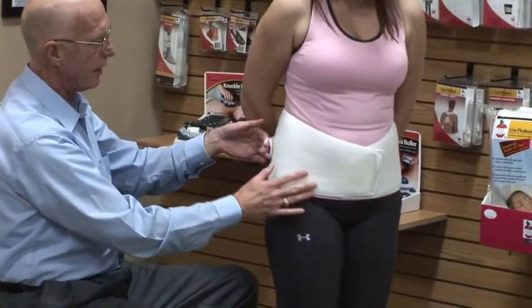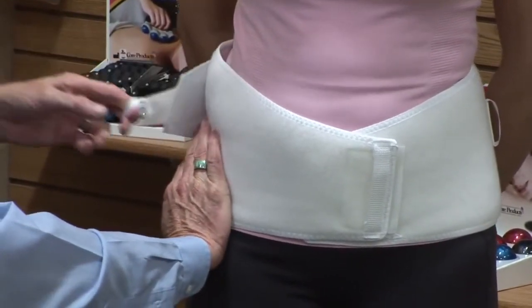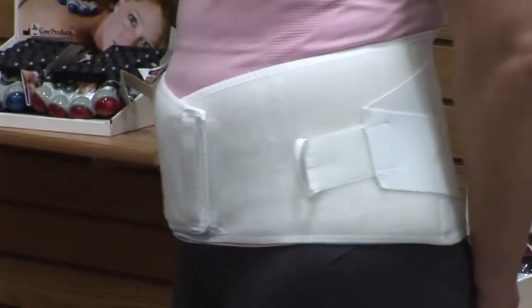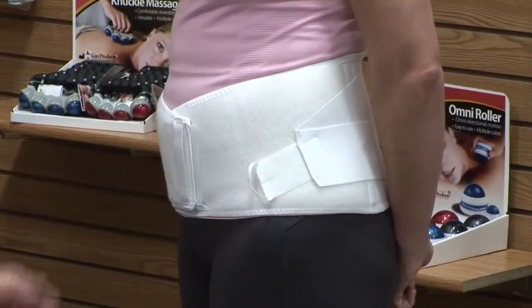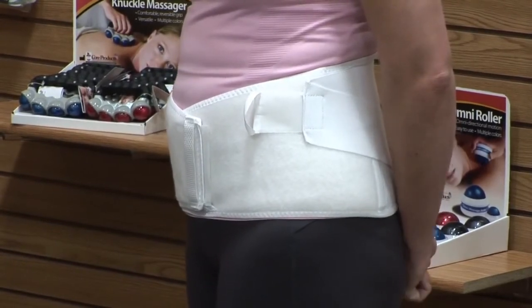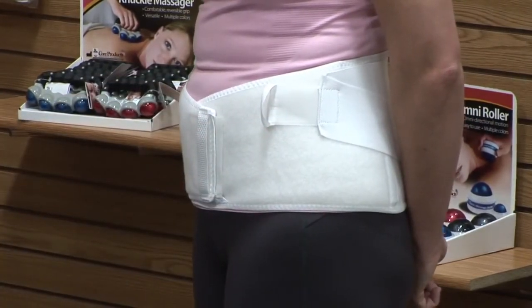There are pull tabs on the side — peel that off. I stabilize the pelvis and then pull on this loop to do the cinch strap, and the same on the other side, teaching the patient that this is what they'll be doing. It's always beneficial to try the cinch tabs in different locations — some patients feel more support with them lower, others higher. Try both sides and both positions to find out where the patient benefits most.